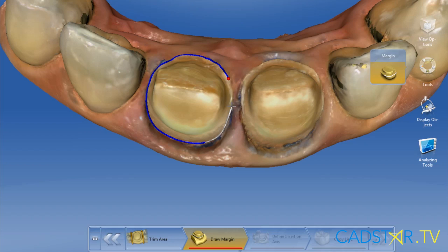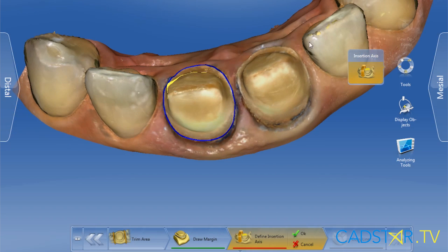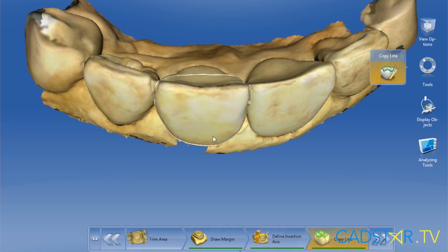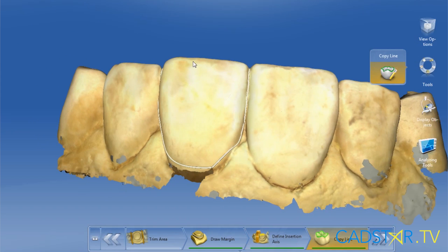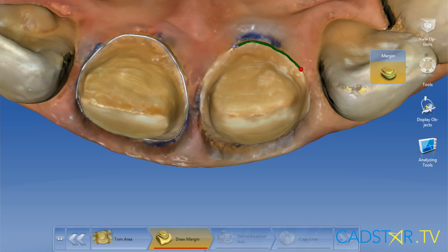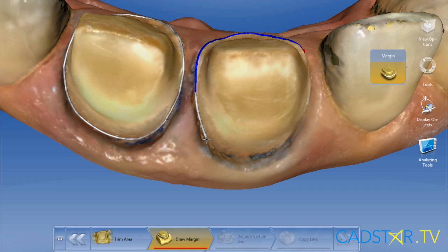With biocopy, there's one additional step in the model phase screen. First step is draw your margin, set your insertion axis — that's step two — and step three is to draw the biocopy line over the wax-up model that was scanned into the computer. Once the computer has those three steps accomplished in the model phase screen, you're ready for a proposal. When you're working on multiple teeth, simultaneous proposals will provide better contact information.